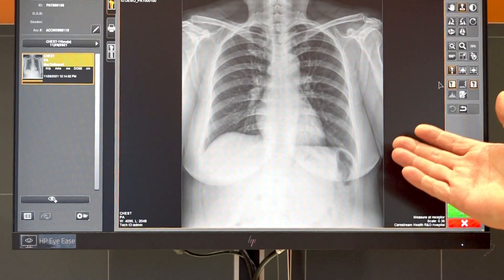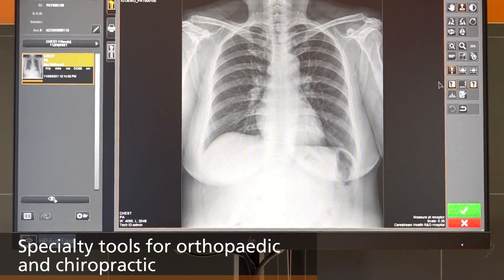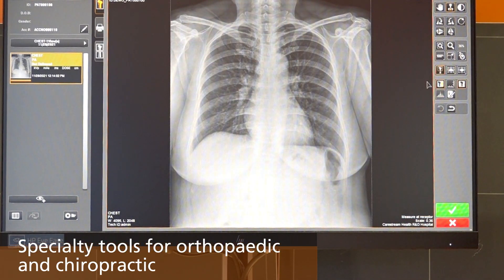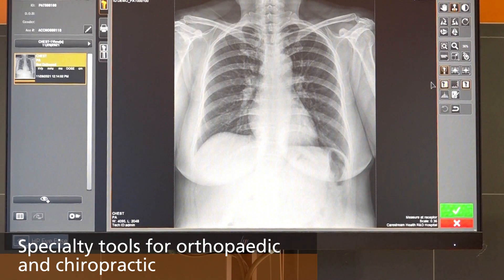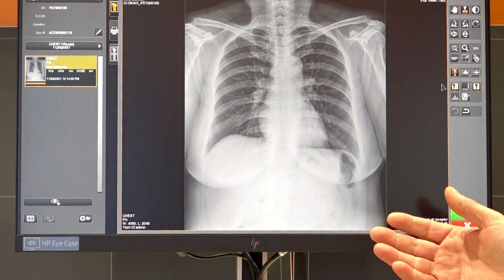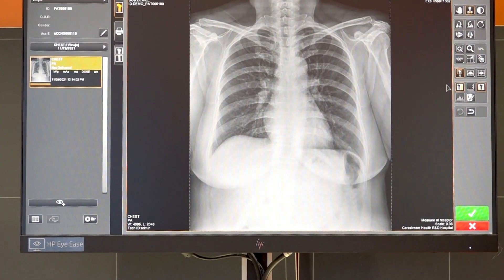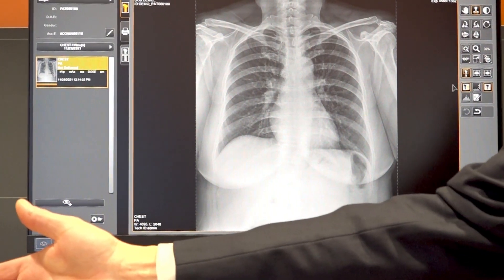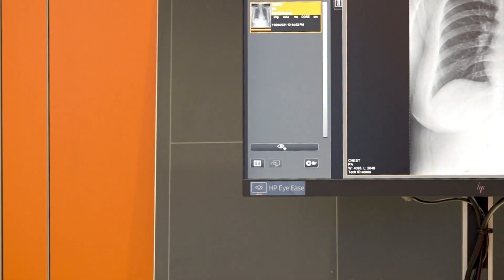We offer several editing tools including markers and advanced measurement tools for specialty practices such as orthopedics and chiropractics. Once you are done with editing and annotation, you can accept the image for delivery to the PACS or to the film printer if diagnosis is made on dry media.